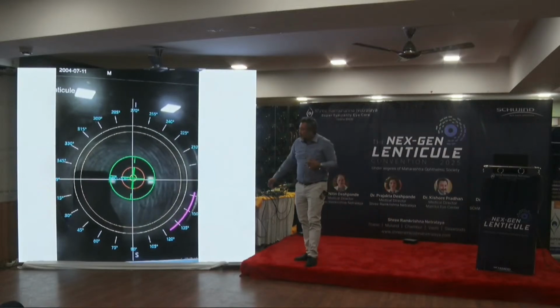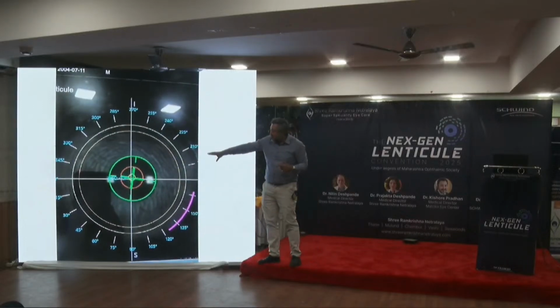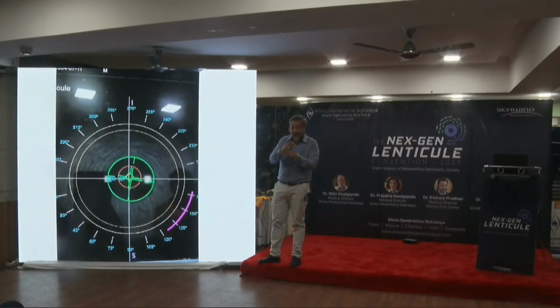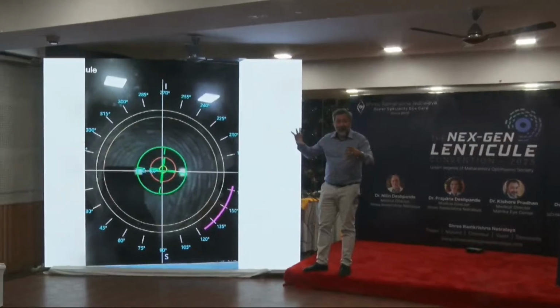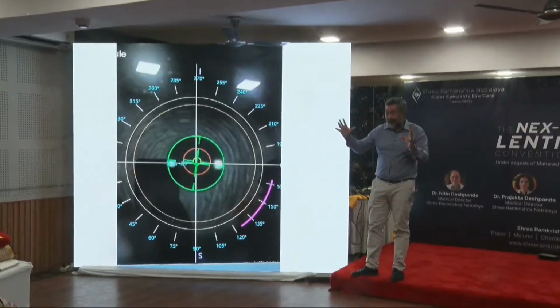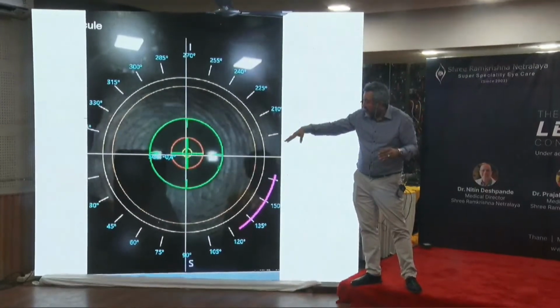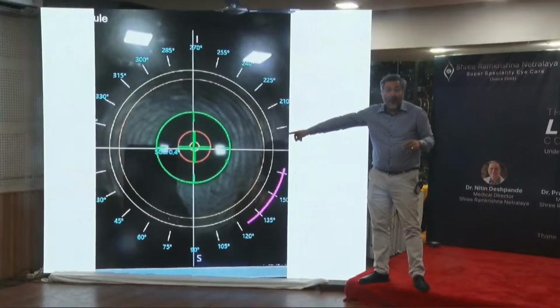You see, this is the longer video. You see the yellow circle is the treatment. It is not in the center of the cross. That is because of the treatment offset. The moment the patient starts squeezing, the eye will rotate in different directions. You can see it's either in this direction or in the other, clockwise, anti-clockwise. And you can actually measure the cyclotorsion on the table.